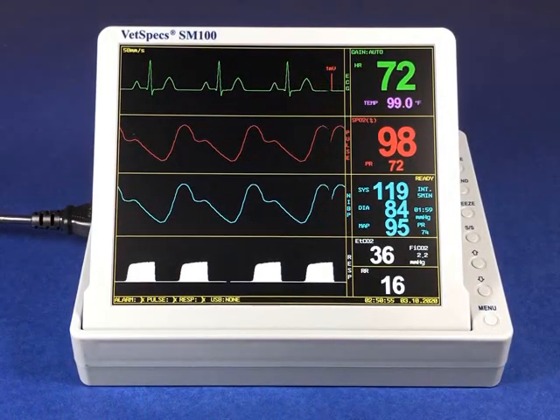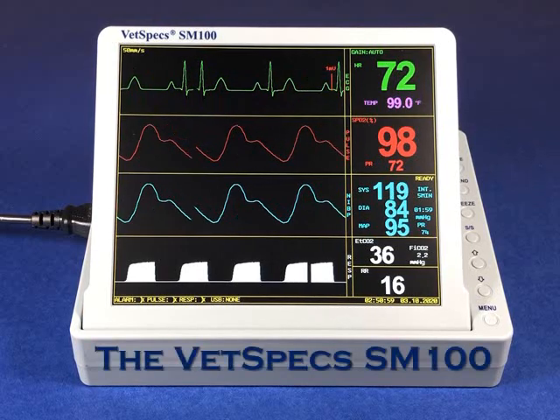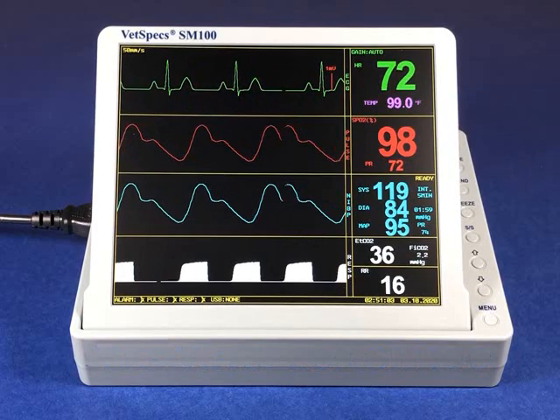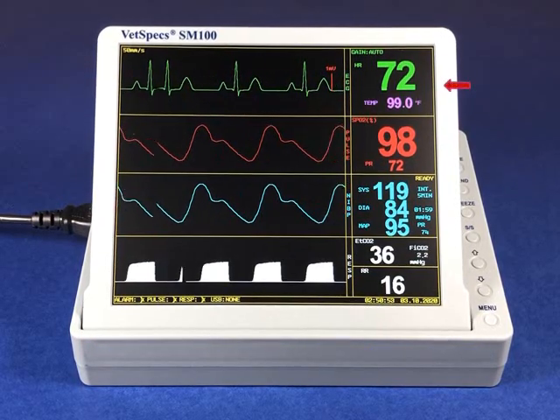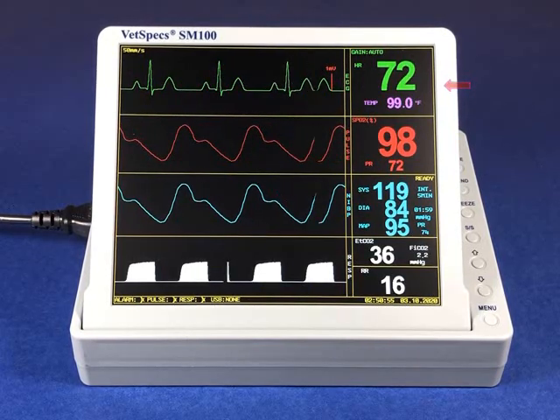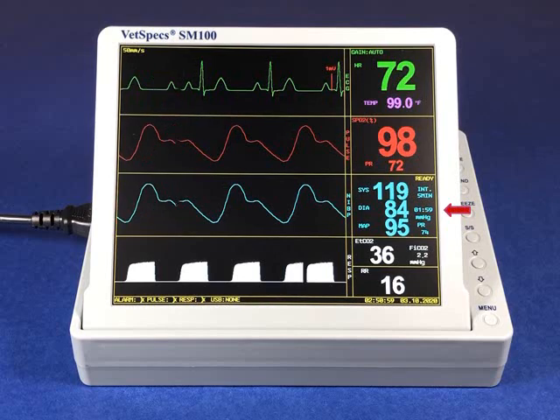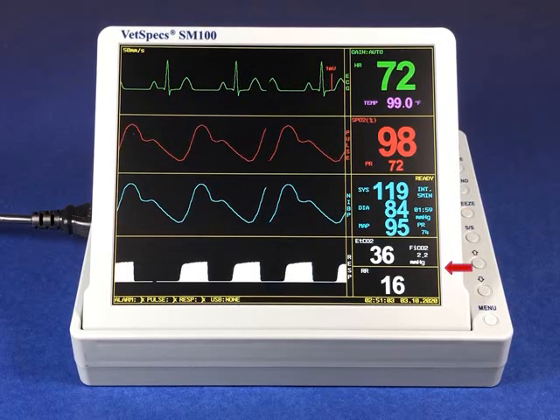VetSpecs Incorporated is proud to introduce the veterinary-specific SM100 Vital Signs Monitoring System. As our flagship model, the multi-parameter SM100 is the embodiment of our modular integration, including ECG with heart rate and temperature, digital pulse oximetry, non-invasive blood pressure, and two different methods of capnography.